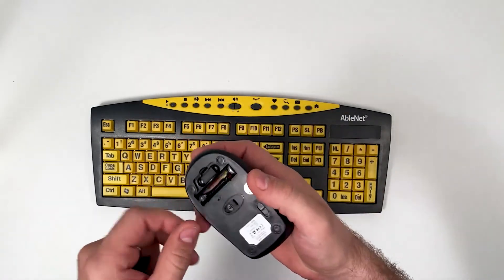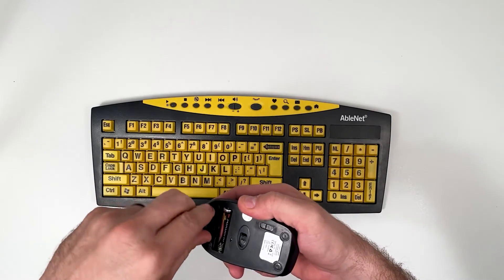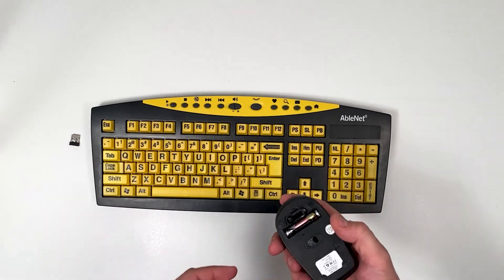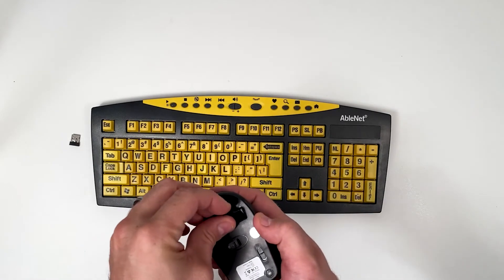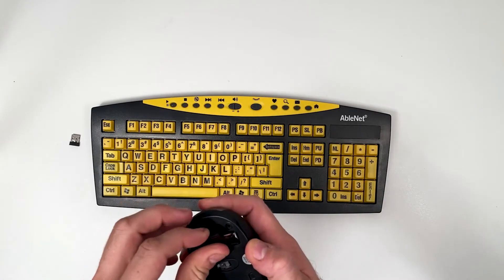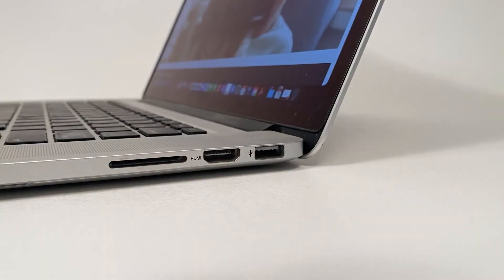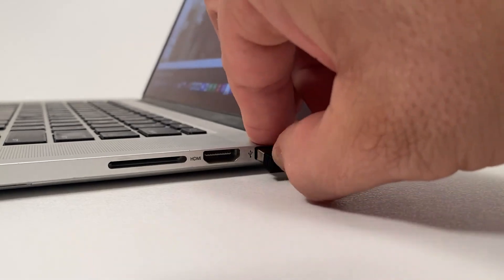Before you close the battery compartment, remove the USB wireless receiver from the battery compartment of the wireless mouse. Then connect the USB wireless receiver to a USB-A port on your device.